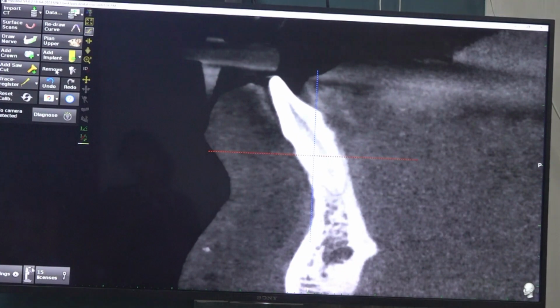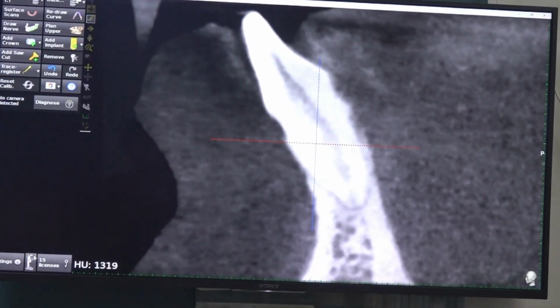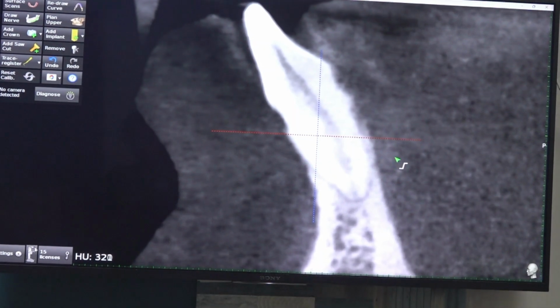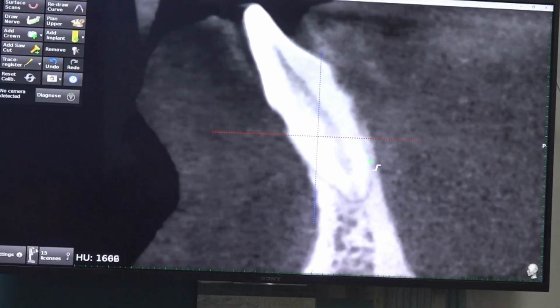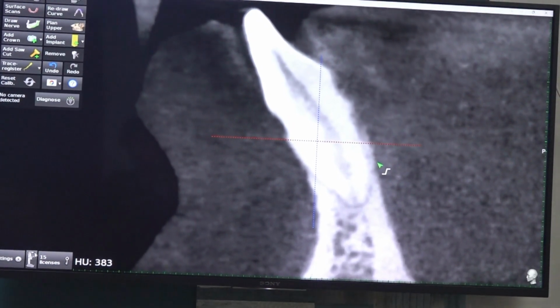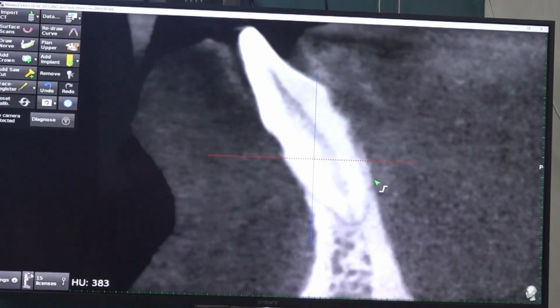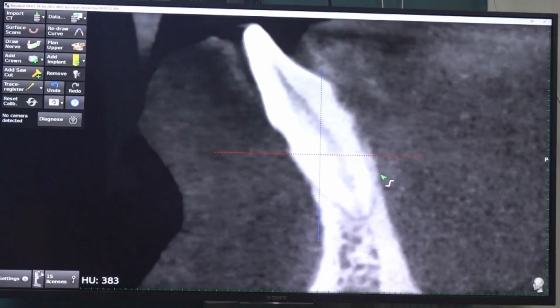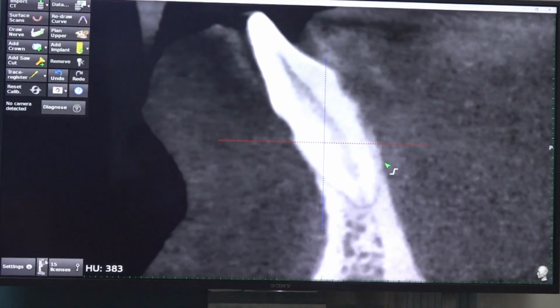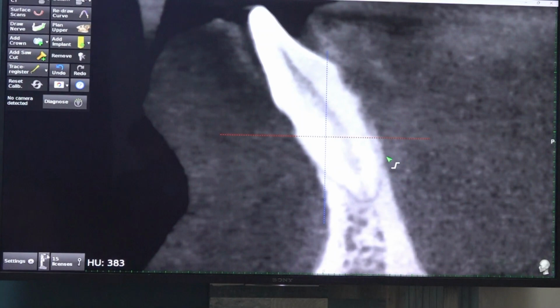See, in this situation, if you do alveoplasty till here, where I am showing the mark, then you can place compressive also. But can you do alveoplasty till that height? If you do alveoplasty till that height, the adjacent canine bone will get compromised, right?